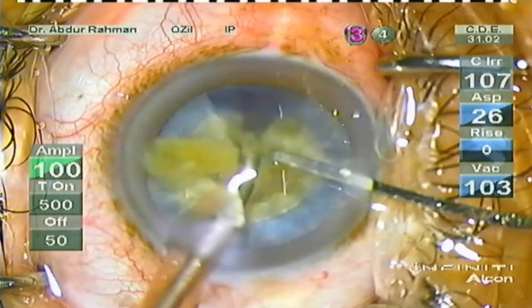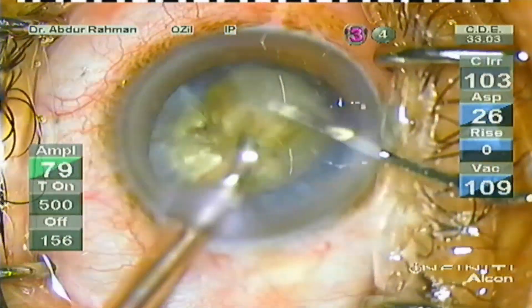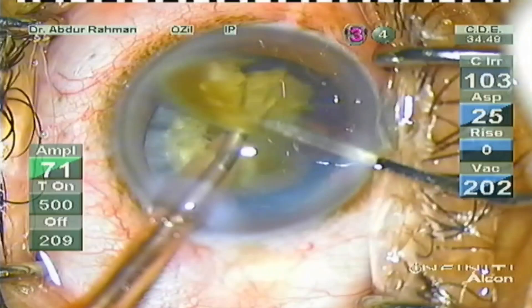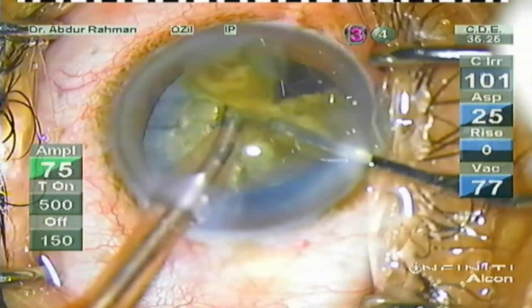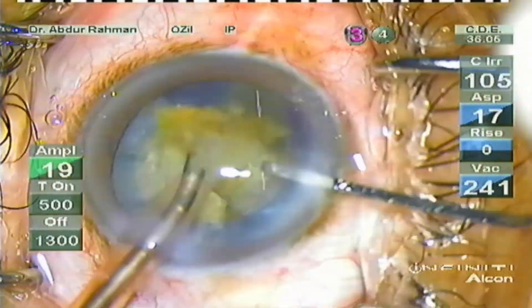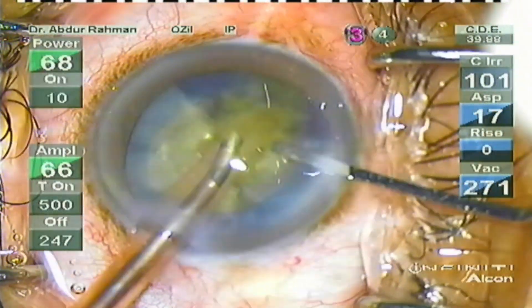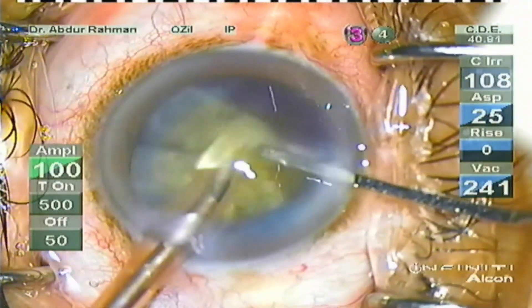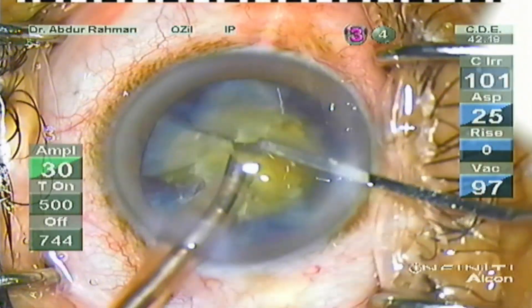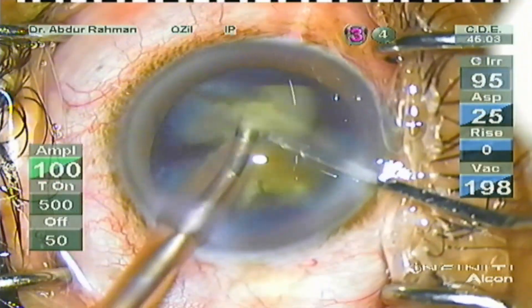Turbulence can cause endothelial cell loss. Now I'm lifting the nucleus slightly to cut the un-chopped piece, then placing the other piece inside the bag and emulsifying the free floating piece. Thereby I reduce lens turbulence in the anterior chamber. The spatula is always there to protect the endothelium.